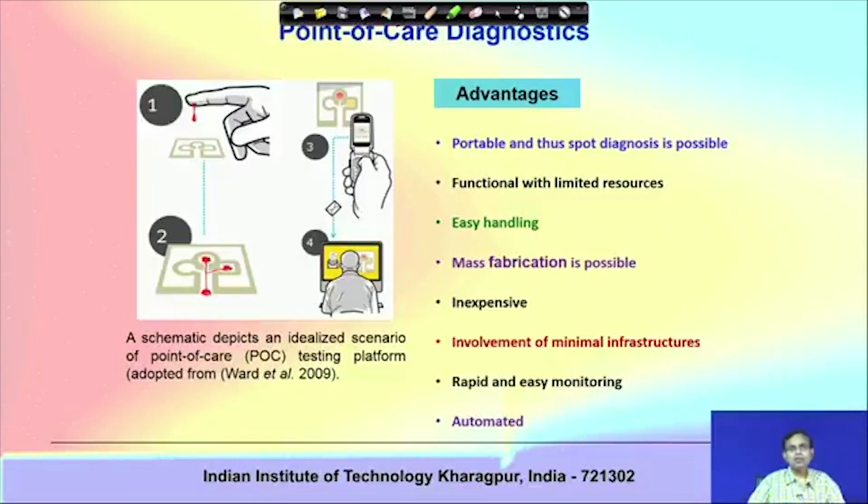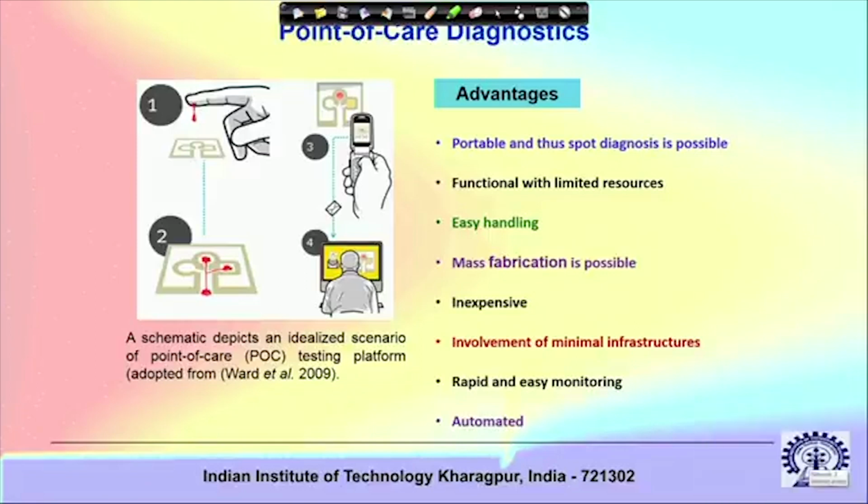It is possible to use a camera, like a smartphone camera, to grab the image, and then image analysis can be done to give the intensity of the pixels under investigation. Now, there is already a calibration of the color intensity of the pixel against the biomarker being investigated, for example, hemoglobin concentration or glucose concentration: how many milligrams per deciliter will correspond to what intensity of the pixel.